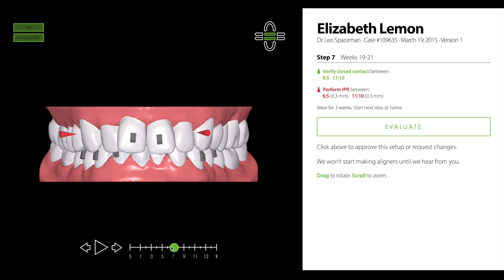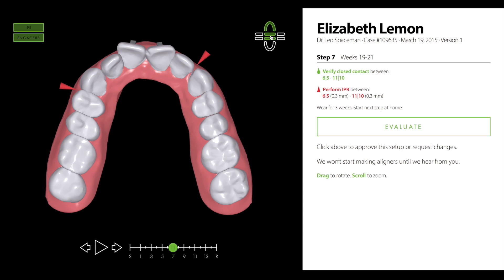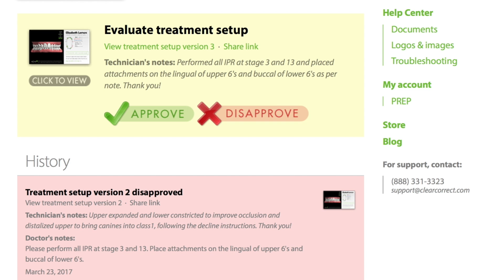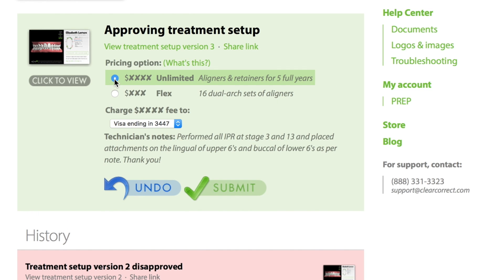As the prescribing doctor, you are ultimately responsible for your patient's orthodontic care. When you're done reviewing the setup, click Evaluate to return to the case page. If you're happy with the treatment as shown, click Approve.